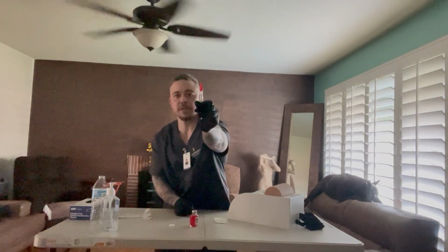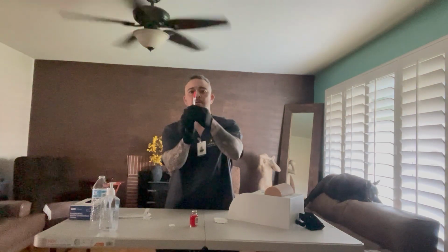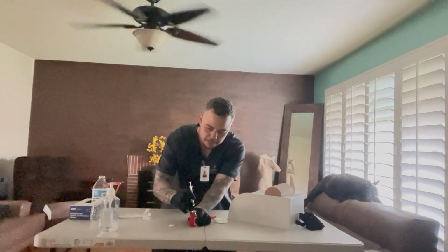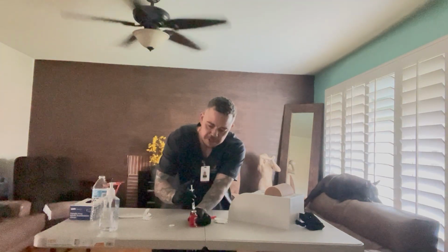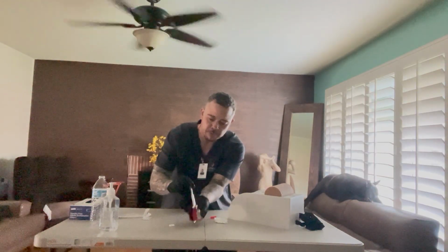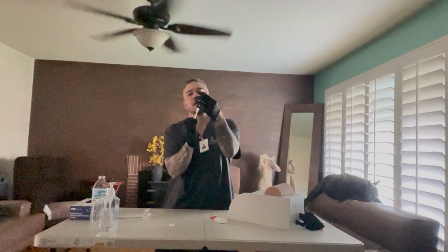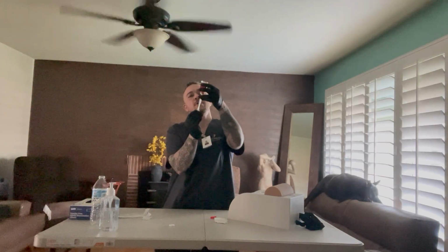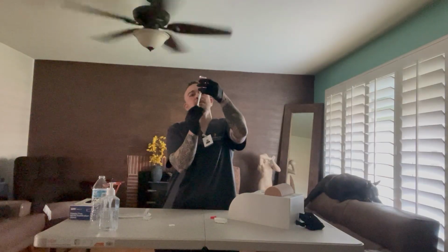Not sure if you can see that, but okay. The next thing I'm gonna do is take my cap off and put the needle into my vial and push the air down into the vial. Then I'm going to invert my vial and withdraw 0.1 milliliter.